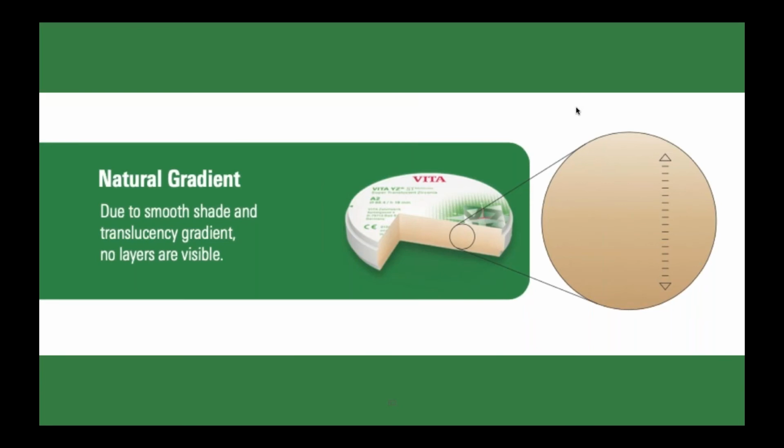You don't want to have a Trilux block that looks like Neapolitan ice cream. You want to have a smoother transition. That way, you can hide the difference between a central and a canine. You can have them all look the same like they want. And of course, these are really nice looking pucks. I'm using them now for a bit.